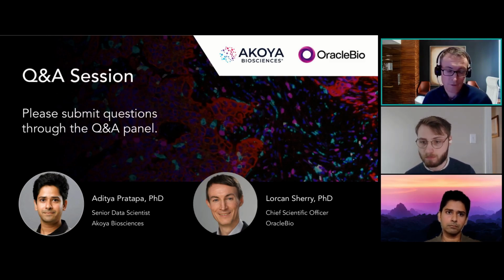Certainly, we can validate the algorithms. It's a bit more complex to validate multiplex fluorescent algorithms compared to the algorithms that have been developed for bright field chromogenic images. But we normally take a dual approach to the algorithm development. Firstly, we think of the tissue classifier algorithm, the one that is segmenting the tissue into different regions of interest. So if that was tumor or oncology tissue, it'd be tumor and stroma regions of interest.